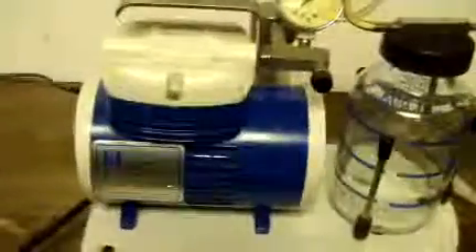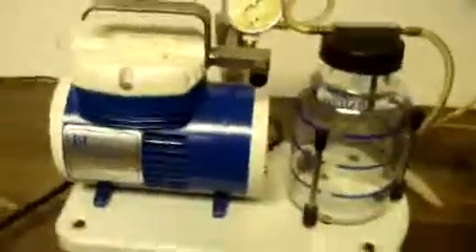We're looking at a GenMed Aspirator, model A. It's in real nice cosmetic condition. I'll go ahead and turn it on.